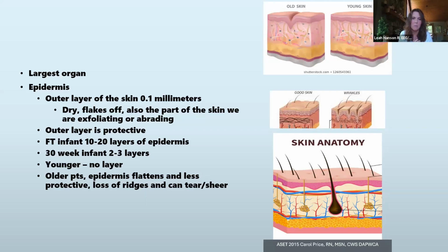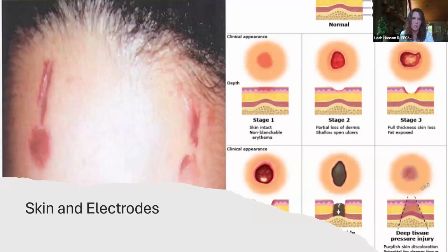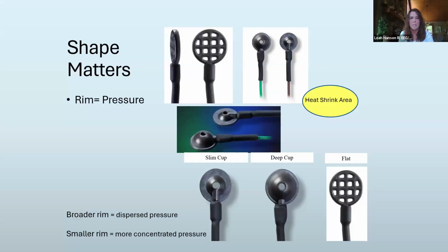FASET's got great materials on this. I'm not going to go deep into it, but the reality is, just by applying the electrode, we are introducing some risk. If you add a little heat, a little dangerous environment to it, it makes it even worse. This is an example on the left showing a pressure injury from the lead wire. This patient came right out of the MR, and somebody who didn't know anything about our application technique could confuse this with something else. So that's why you need to understand your responsibility of application, and also of pressure and using flat leads. That's what this slide's about.